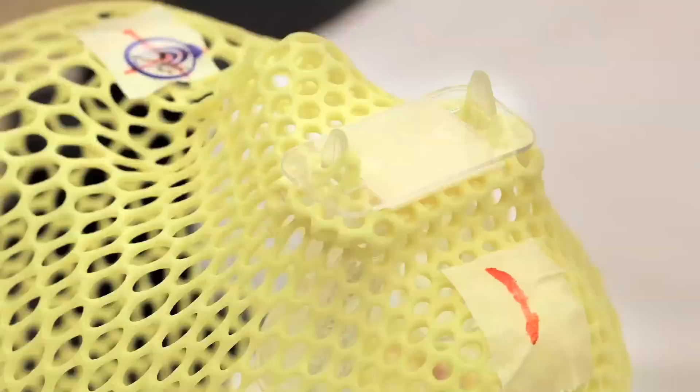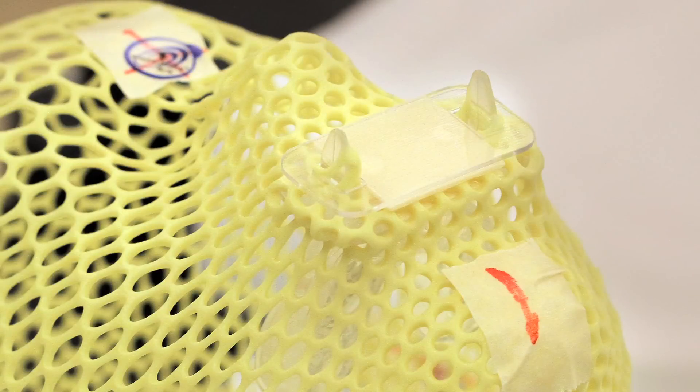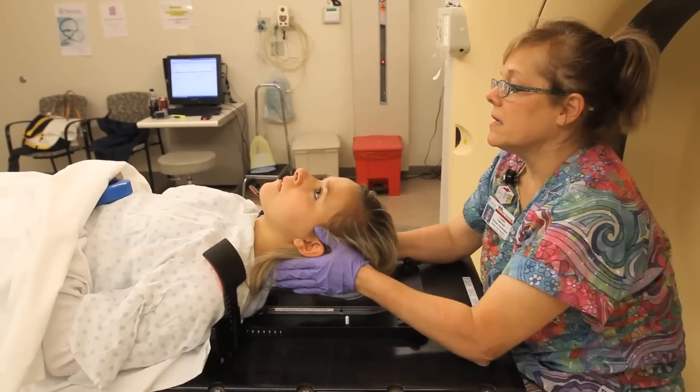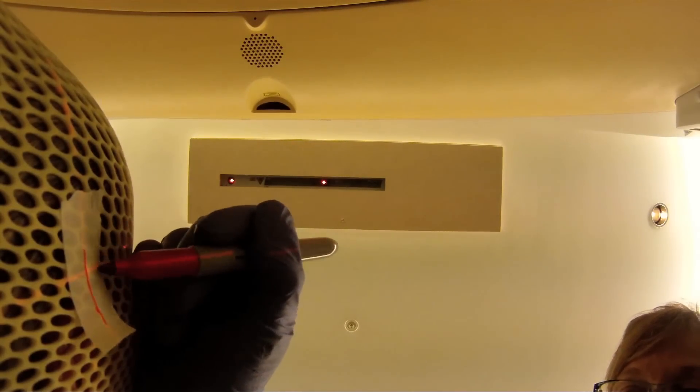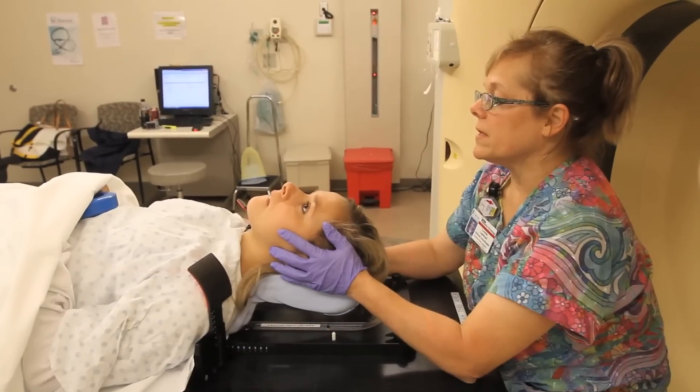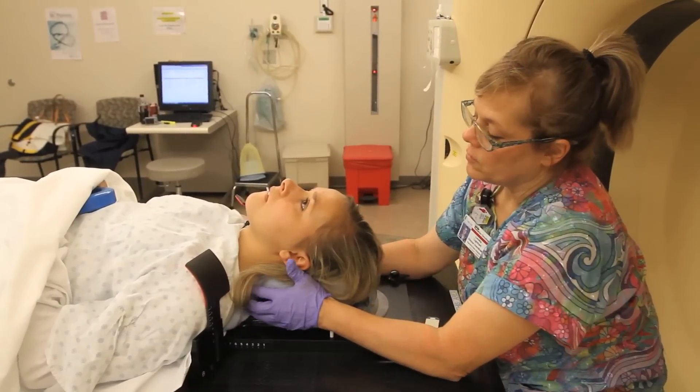We're going to make a mouthpiece like the athletes wear and it's going to hook onto the mask. What this does is it helps focus where the beam is — it helps you not move your head up and down — so we can focus the beam just where the position your doctor wants it.